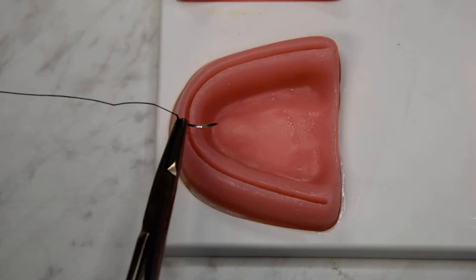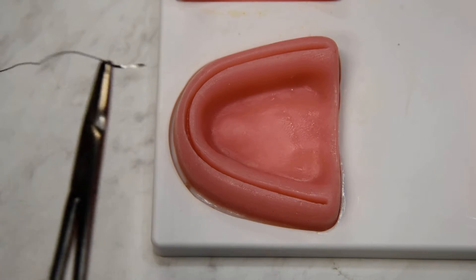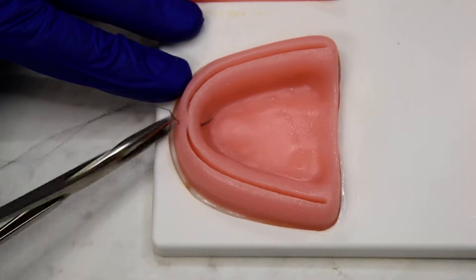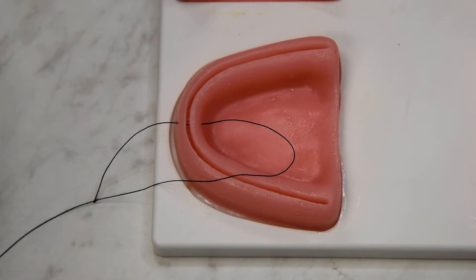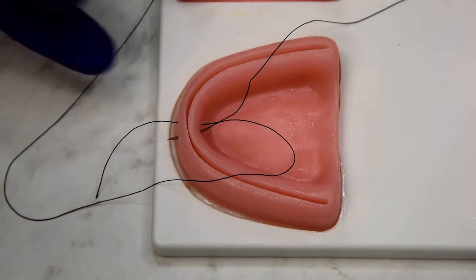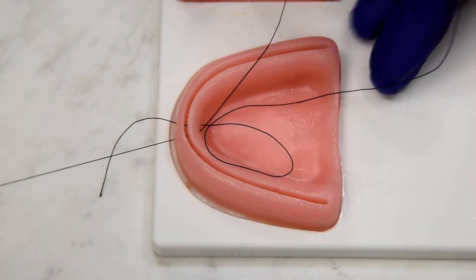When we close a full arch, often times we're doing mattress sutures and then some sort of continuous. The Texas Two-Step combines both by starting at the midline and throwing a mini mattress — by that I just mean a kind of skinny mattress — so the jump from distal to mesial is minimal.